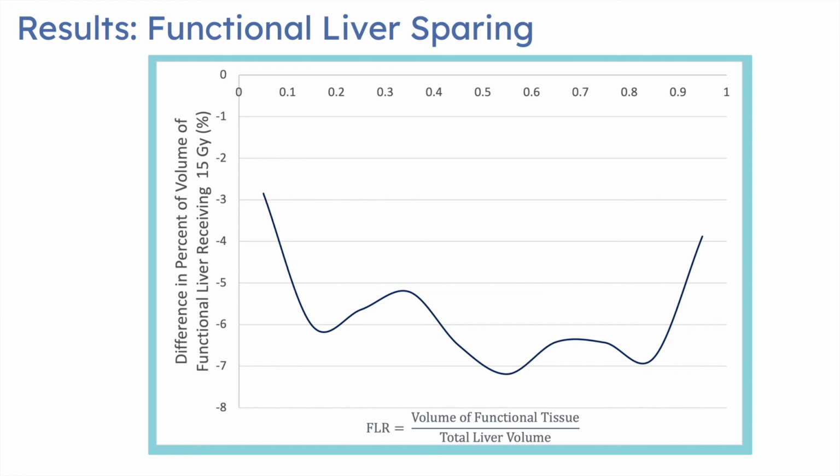This gives an interval of FLR values where the increased workload associated with functional treatment planning shows a significant enough benefit in the ability to spare the functional tissue for the patient to be considered for functional treatment planning.